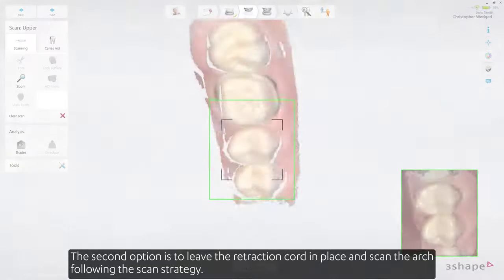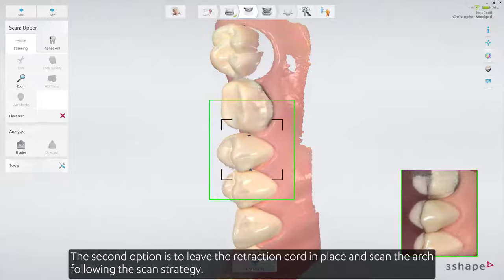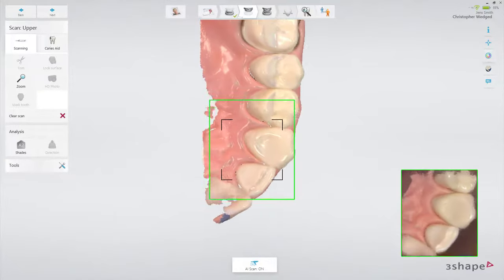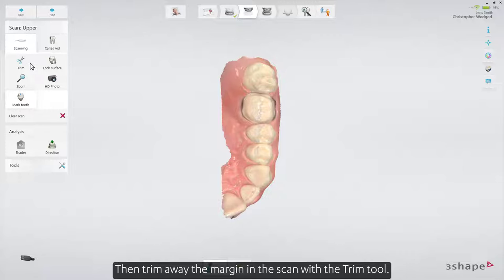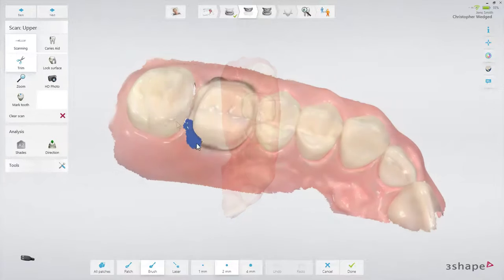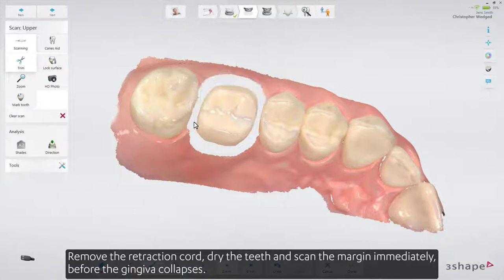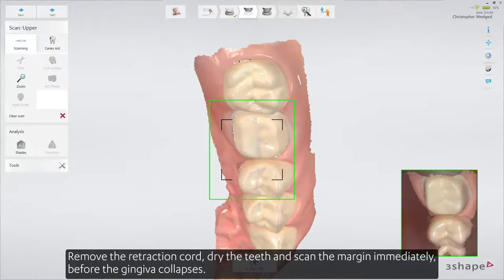The second option is to leave the retraction cord in place and scan the arch following the scan strategy. Then trim away the margin in the scan with the trim tool. Remove the retraction cord, dry the teeth and scan the margin immediately before the gingiva collapses.